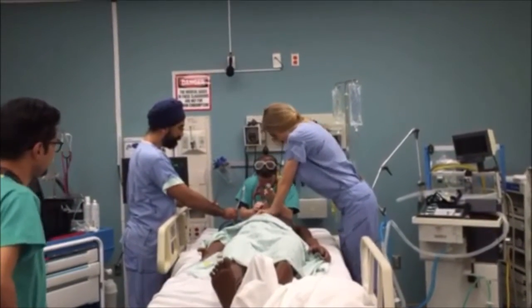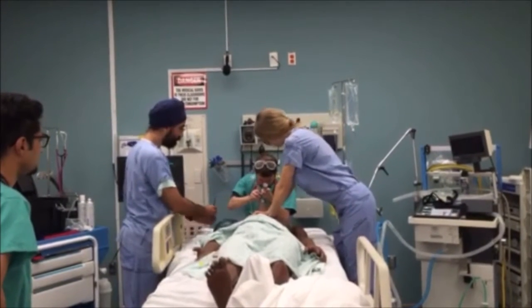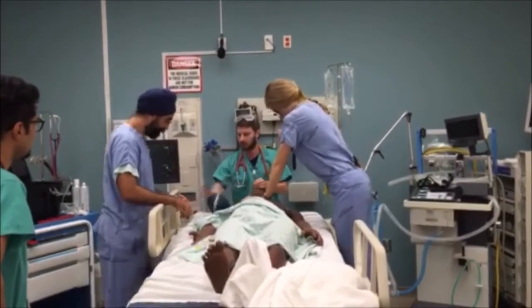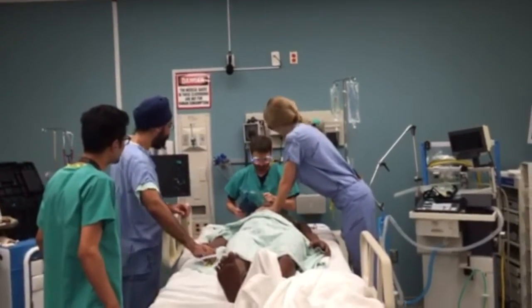I see epiglottis. I see cords. Oh, this is an easy one. Oh, this is good. Definitely in. We can attach our ambu bag. Easy intubation. Alright, so what's the end-tidal CO2?